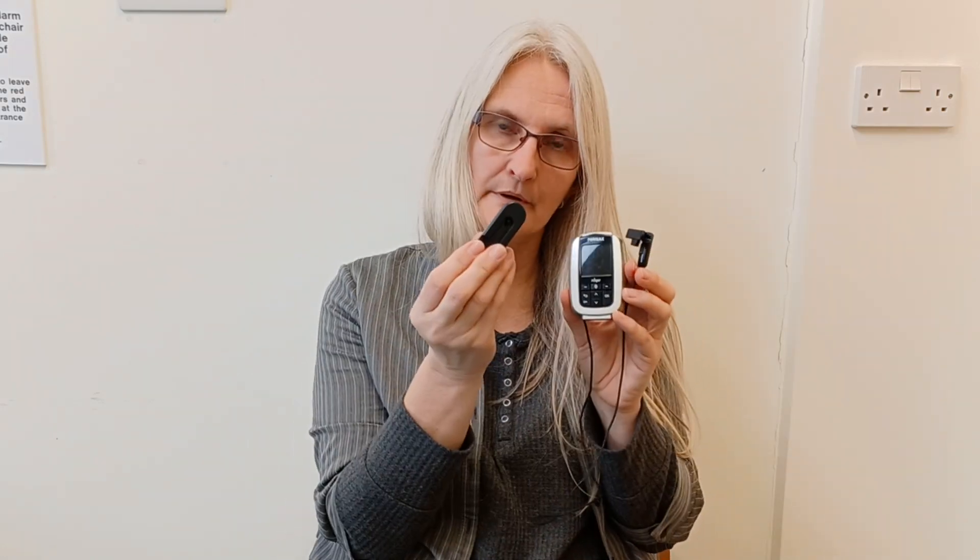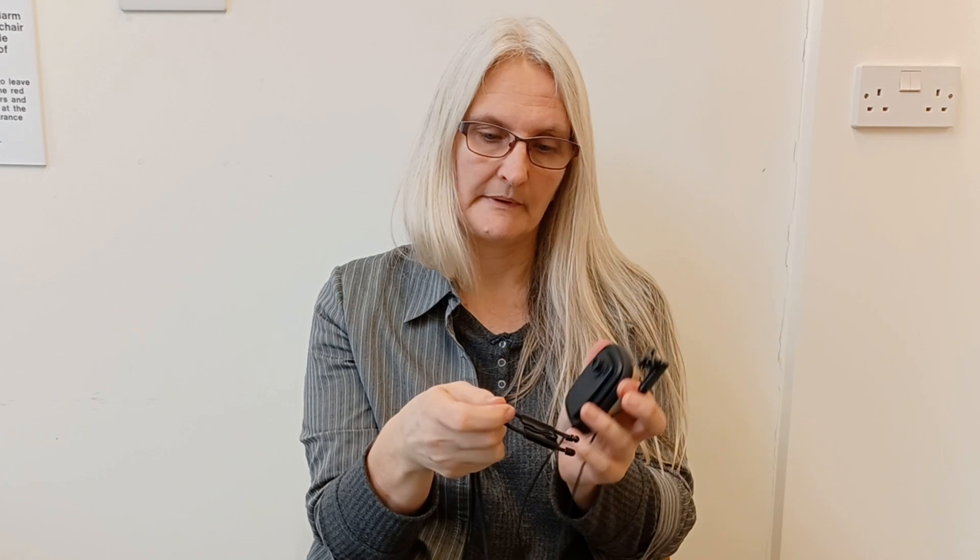There are two ways of wearing the Inspiro. You can either use the belt clip or you can use a neck lanyard. They both connect onto the knob at the back, so if you slide that on, you'll get that click.